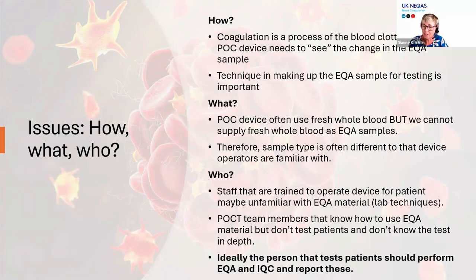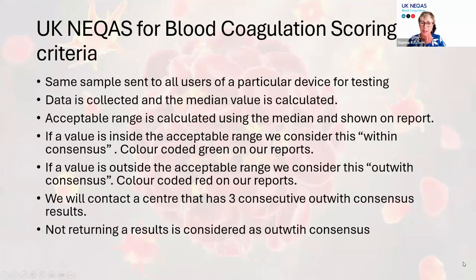And of course, when we talk about the end users, it's staff that are trained to operate the devices for the patients, who may not be familiar with EQA and lab techniques. And we might have point of care teams supporting them who are familiar with EQA and the lab methods, but don't necessarily understand the patient's tests or the devices. So in general, I would say it's ideally the person who does the testing who should do the IQC and EQA. And I think that comes back to engaging them to get them on board with doing QC. Once they're on board and see the value of it, then it really is better if they can perform those tests.